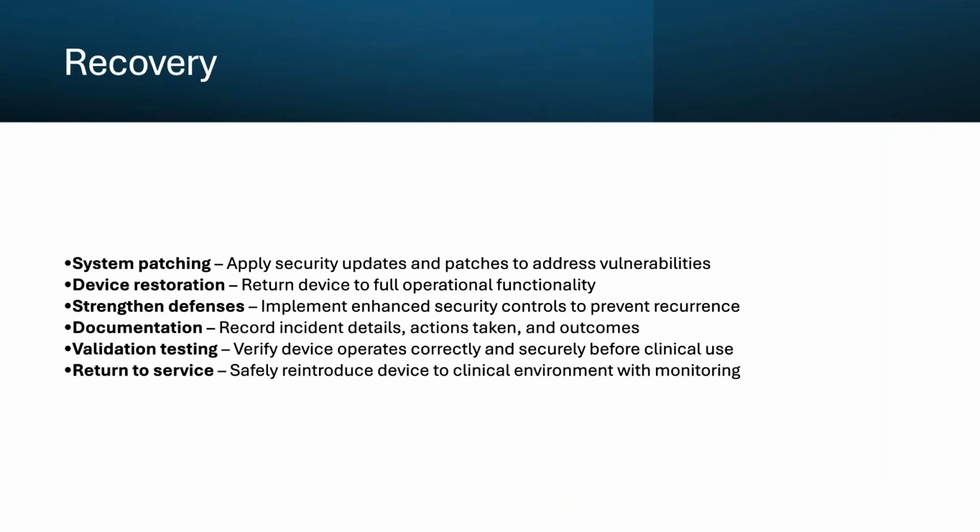Before any device returns to patient care, rigorous validation testing is mandatory. We must verify the device operates correctly from both clinical and security perspectives through functional testing, security scanning, and simulation testing. We might run test patients, verify calibration, and confirm the device communicates properly with our systems. Finally, we safely reintroduce devices to the clinical environment with enhanced monitoring.